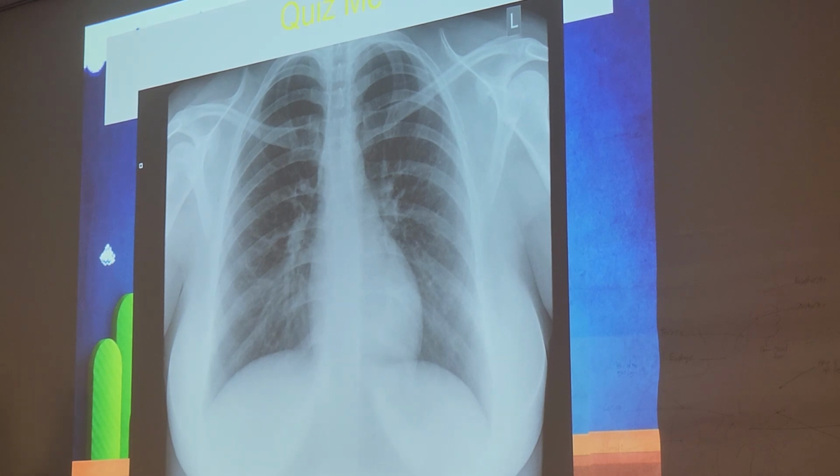I saw some hands go up. If it's a pediatric and we accidentally clip the marker, and we repeat that X-ray just to get the marker in there? In pediatrics, yes, at least when I worked there, we did have to repeat them for that. But doesn't that break the principle of ALARA? It does, but they pretty much say that the legal aspects outweigh the safety aspect, at least in a pediatric facility.